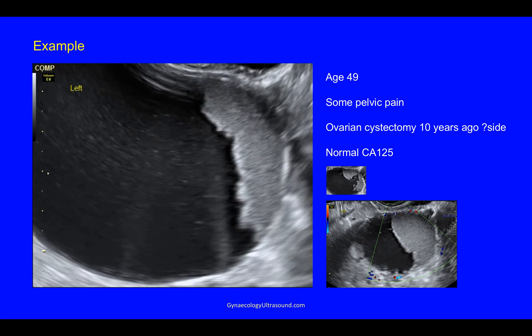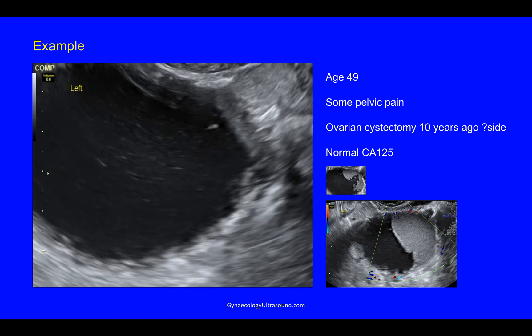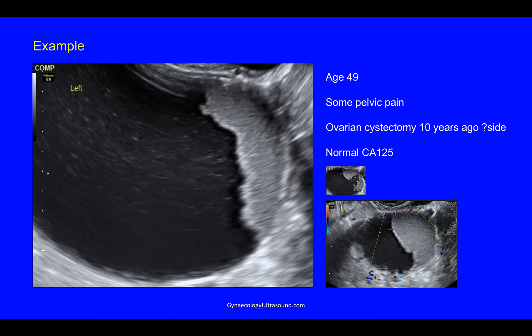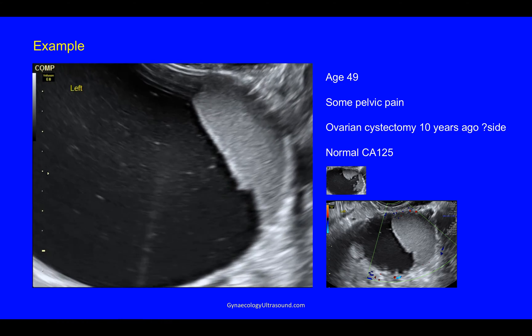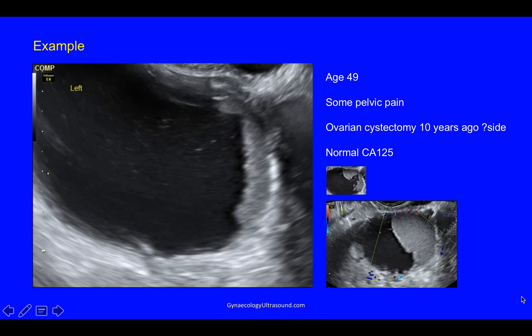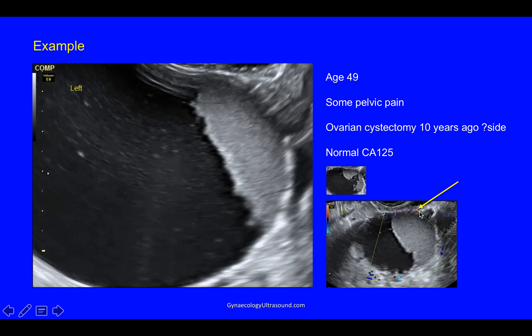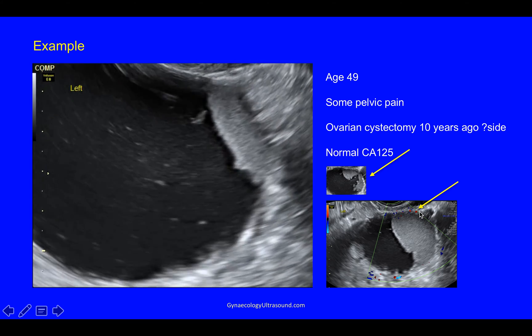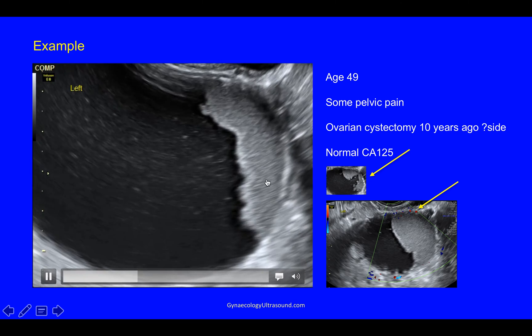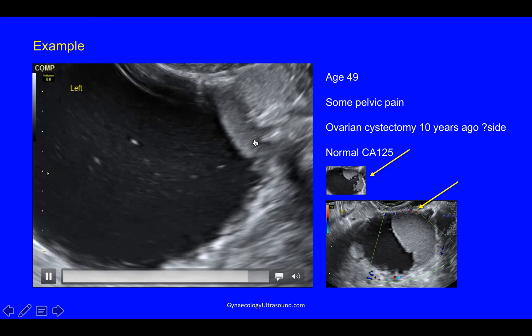Using this example: this patient was 49 and had some pelvic pain. She'd had an ovarian cystectomy 10 years previously — wasn't sure which side. Her CA125 level was normal. Here's a video clip of the examination. On colour Doppler there was a little bit of colour, so that's a score of 2. And in a different plane — you must always scan in at least two planes — you can see that there were two populations, though it wasn't initially clear that this was in fact two populations.